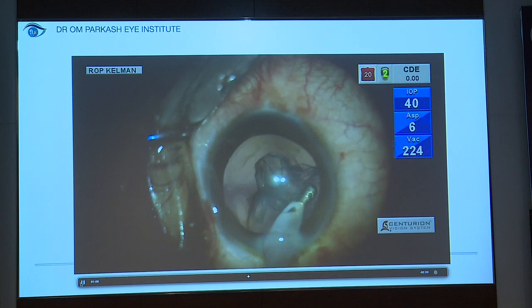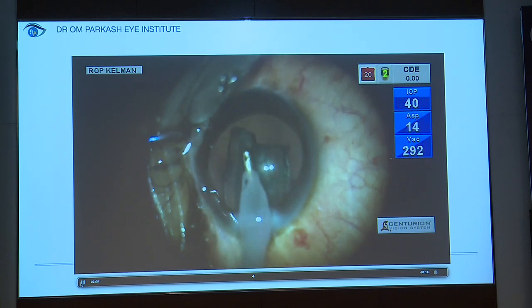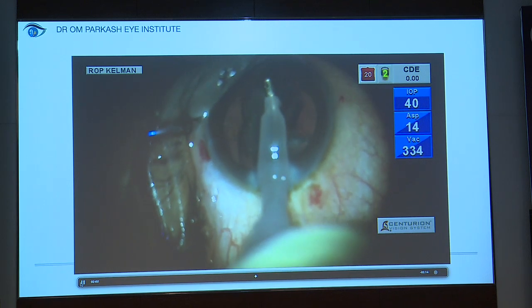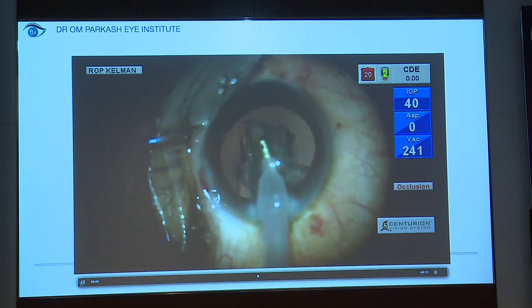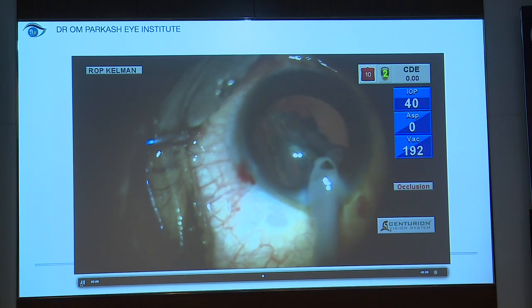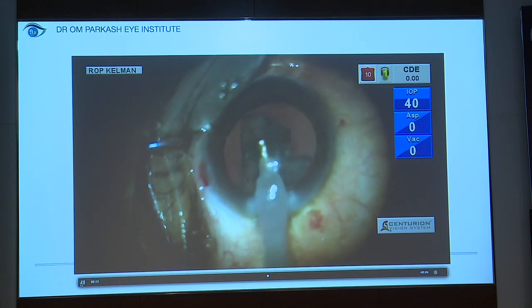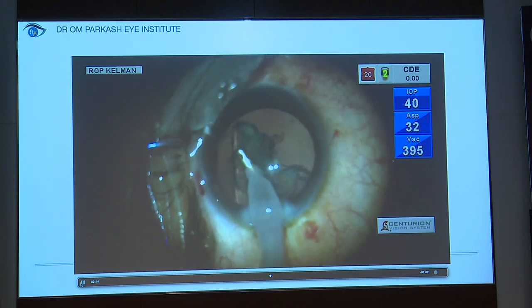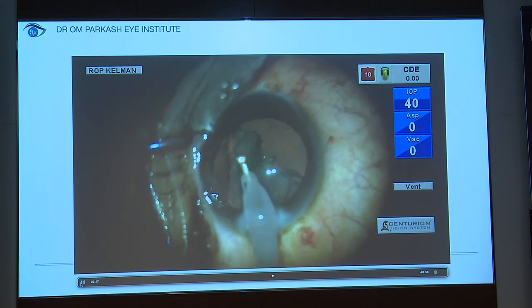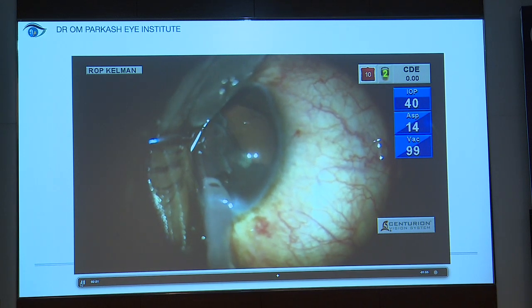I'm not going to aspirate it whatsoever. You will find that I'm dislodging it, and after dislodging it, I'm leaving it there. And then what I'm doing is, I'm just trying to take out the subincisional one. Mark my words, till this point of time, the open posterior capsule has not been exposed to any direct fluidics whatsoever. So I'm using the epinucleus to my advantage by creating an epinucleus shield.